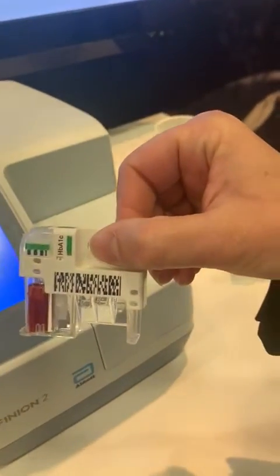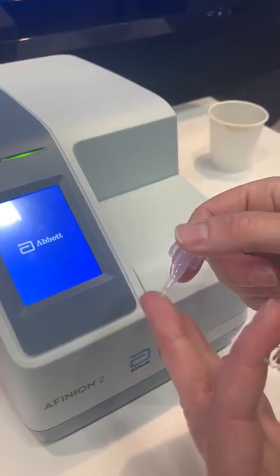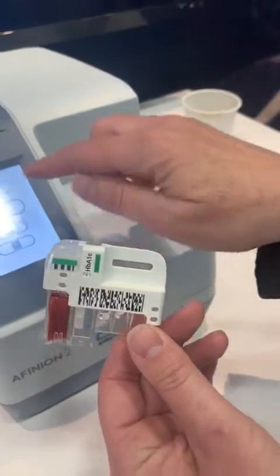This is one test — this is for the hemoglobin A1c. It has an integrated sampling device, like this. Collect your finger stick blood, 1.5 microliters, and put it back in the cartridge like this. And now you're ready to put it into the instrument.